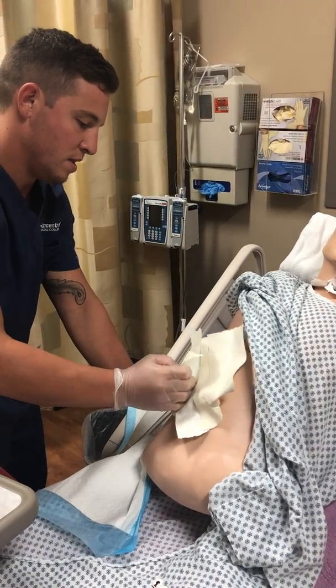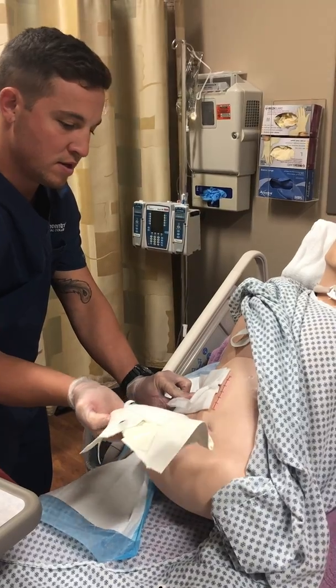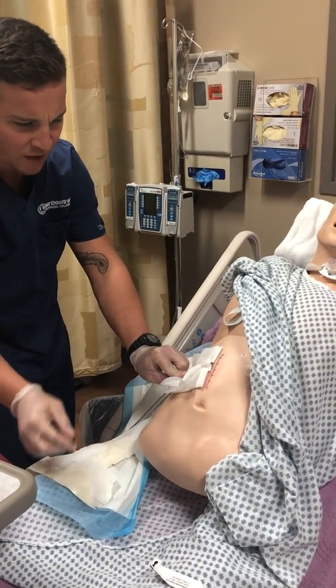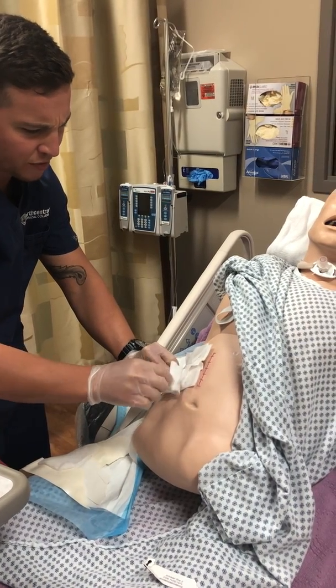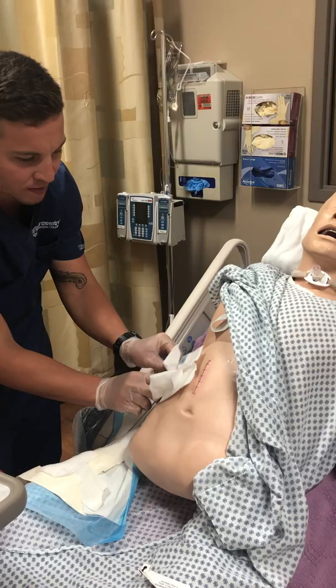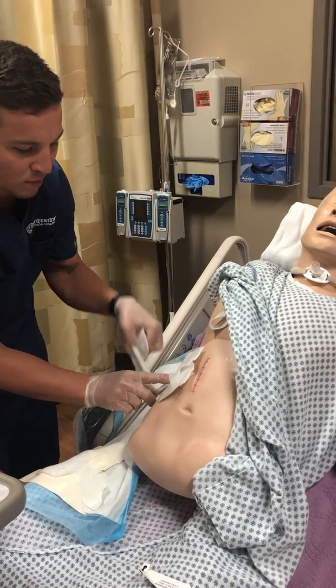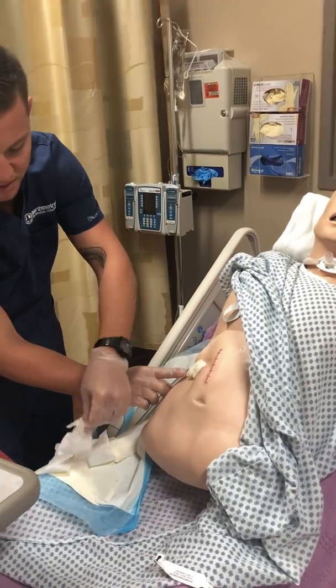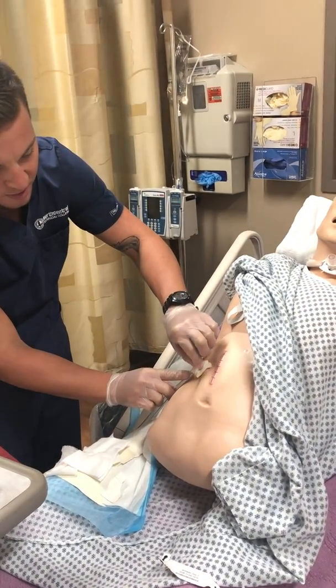Okay, set down our old dressing. Here, let's get this off first. One more.